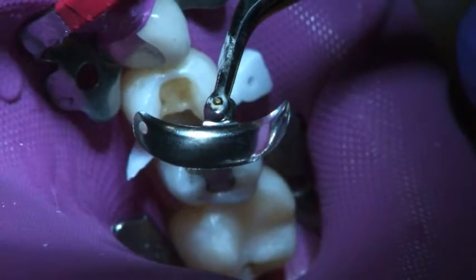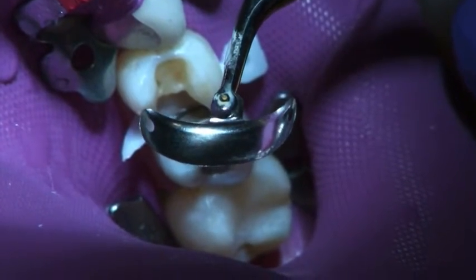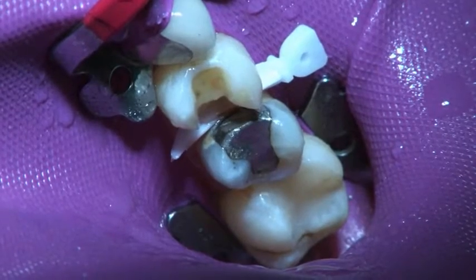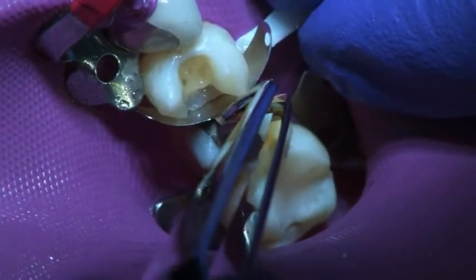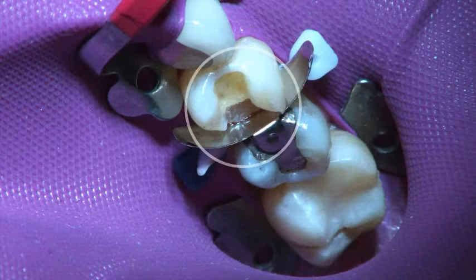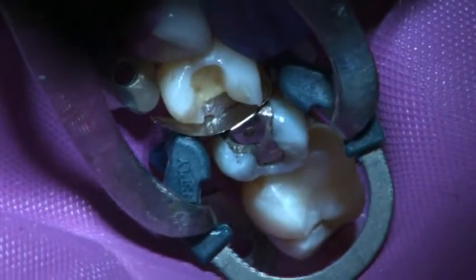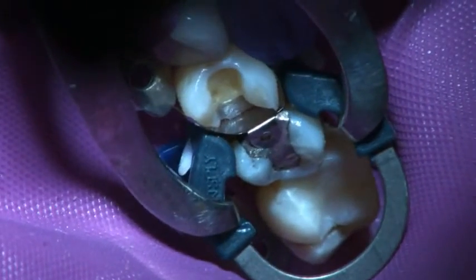Here, I apply the Paladent Plus matrix to a maxillary bicuspid. After we've placed the wedge and broken the angles of the tooth and the gingival line, we ease out the wedge and slide the matrix band down, then slide the wedge right back in. You can see that we've sealed the gingival margin, and now we'll easily line up the marginal ridge. Using the narrow ring of the Paladent Plus system, we'll place it over the wedge and readapt it to ensure a tight seal.